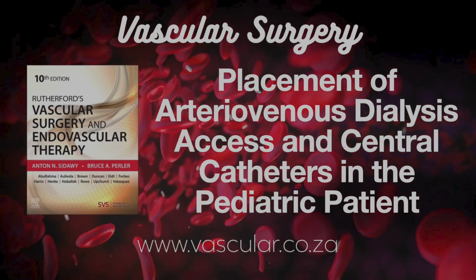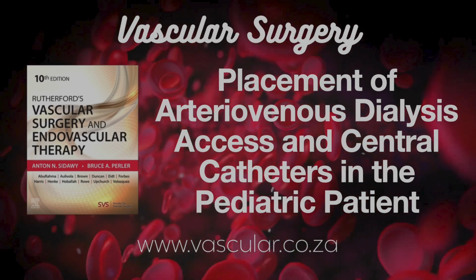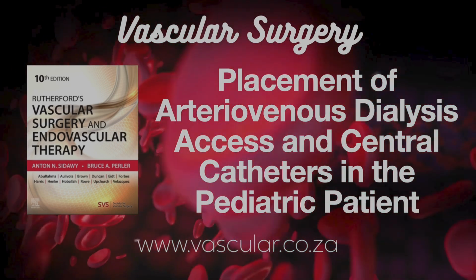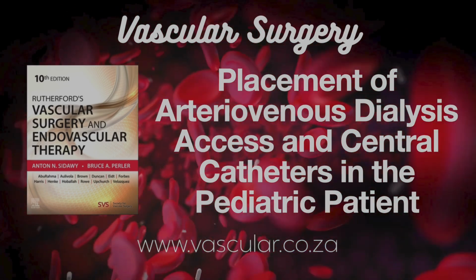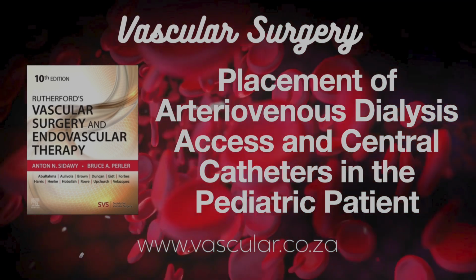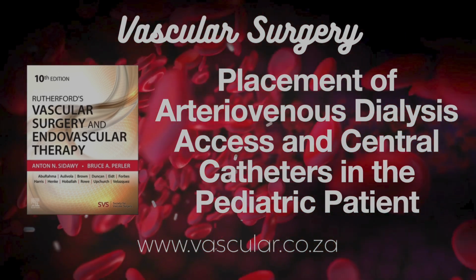Okay, now here's where it gets really interesting. The National Kidney Foundation, NKF, has these KDOQI guidelines, pretty clear recommendations. Very clear. They say for kids and teens 0 to 19 years old, over 20 kilos, who aren't expected to get a transplant within a year, the preferred access should be a permanent arteriovenous fistula, an AVF. A fistula. But that's not what usually happens.